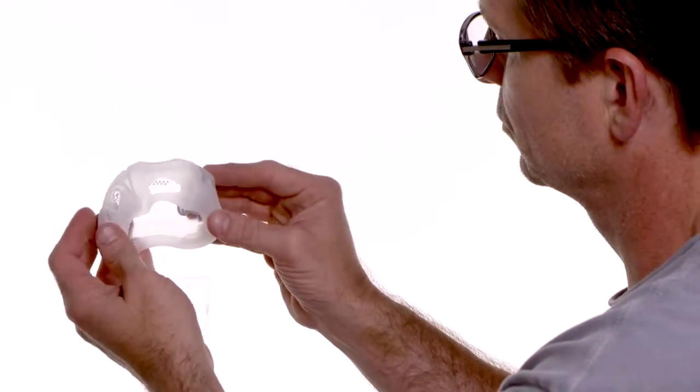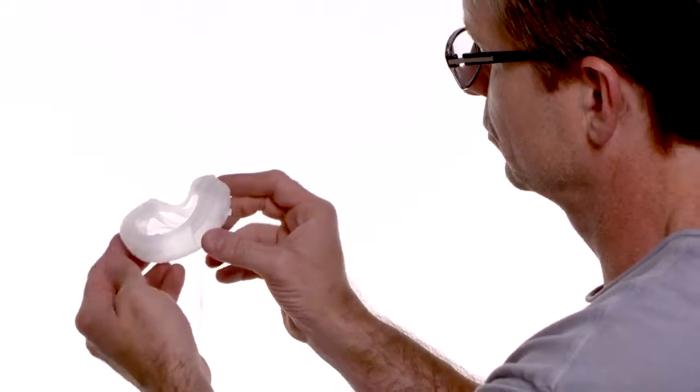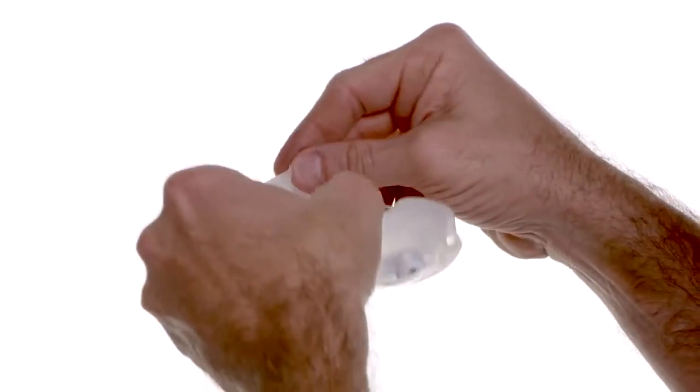Inspect your mask regularly for damage or wear, such as cracking or tears. Discard and replace parts as needed.